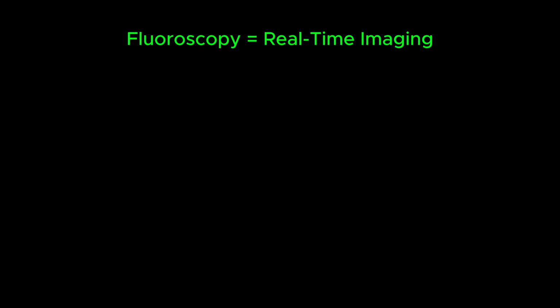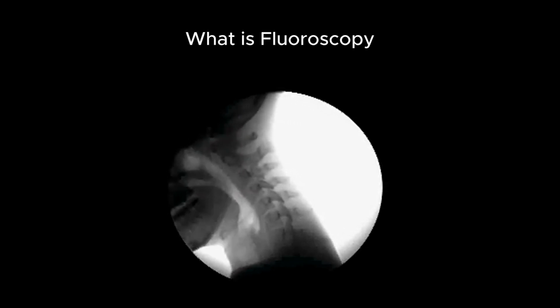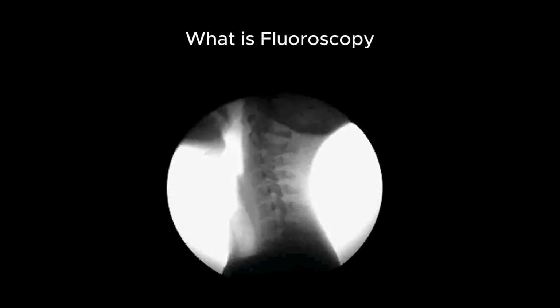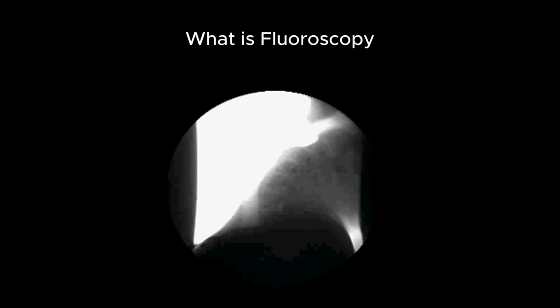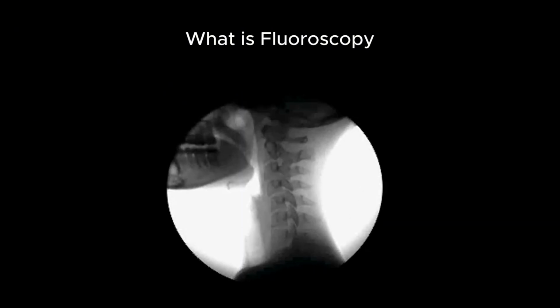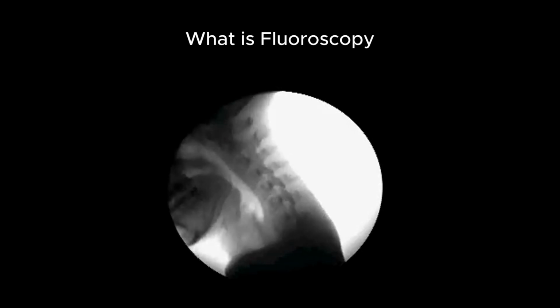Let's dive in. So what exactly is fluoroscopy? In simple terms, it's an imaging technique that allows you to see real-time movement inside the body using x-rays. Unlike a traditional x-ray, which gives you a static, still image, fluoroscopy gives you a live video feed. Imagine watching a barium swallow, seeing the contrast material move through the esophagus in real time, or watching a catheter being guided through a blood vessel during angiography.